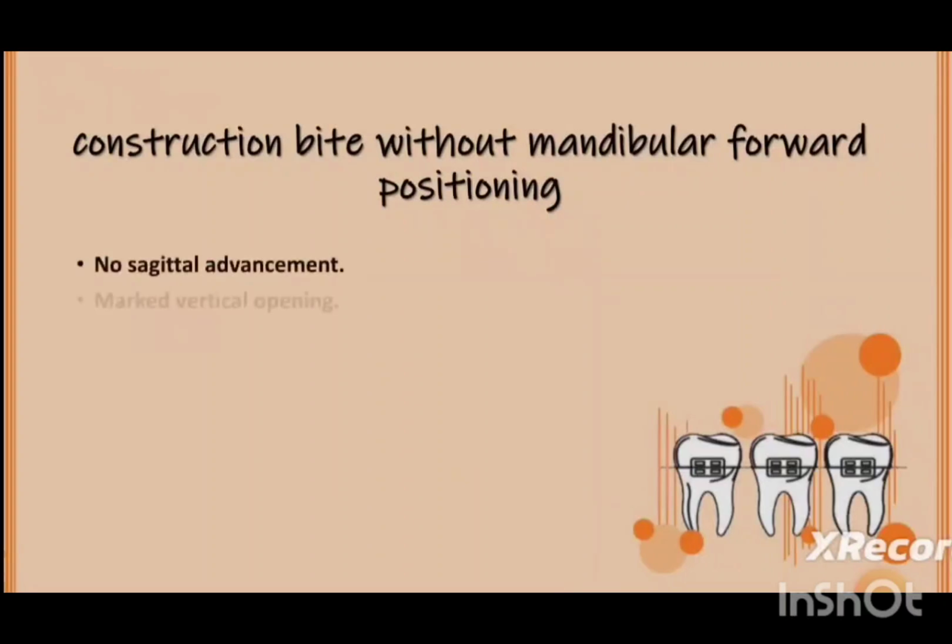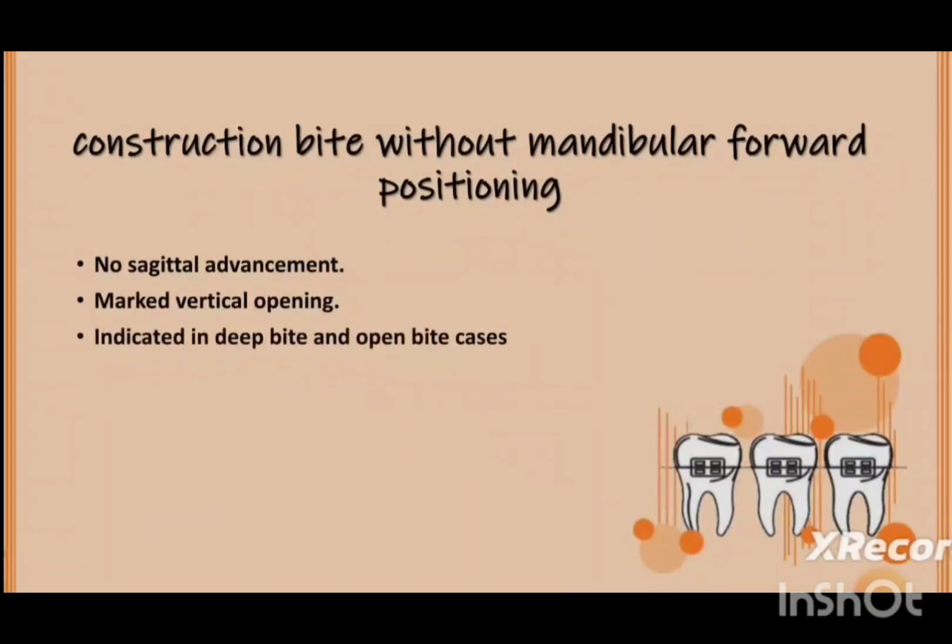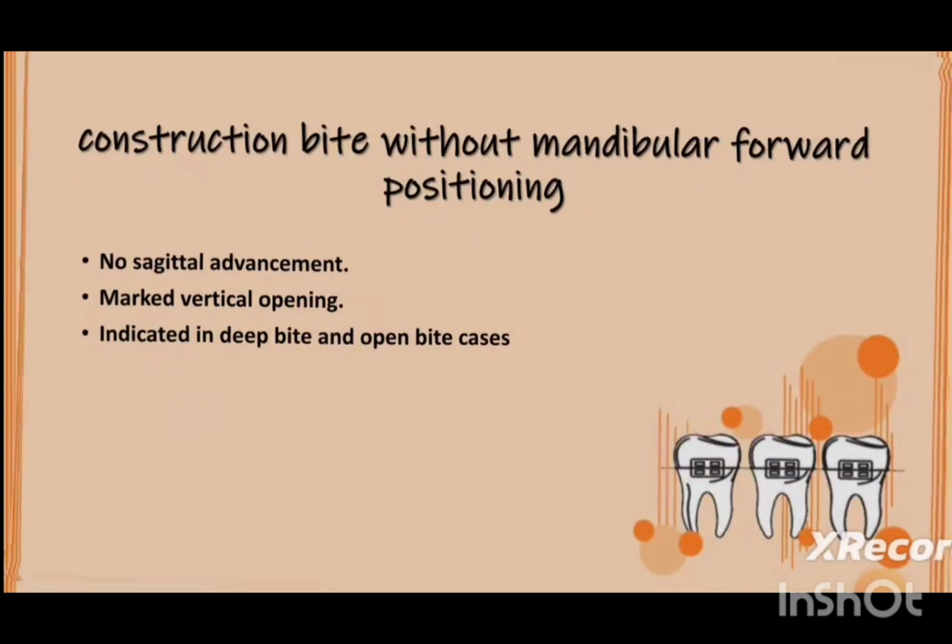Now we have construction bite without mandibular forward positioning. No sagittal advancement is made, only marked vertical opening is maintained. Now this is indicated in deep bite and open bite cases.